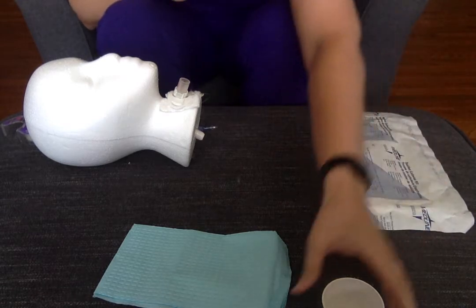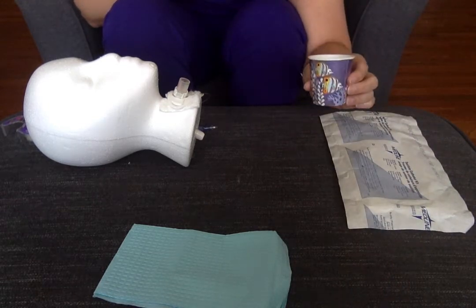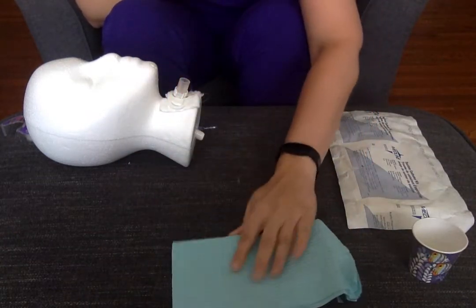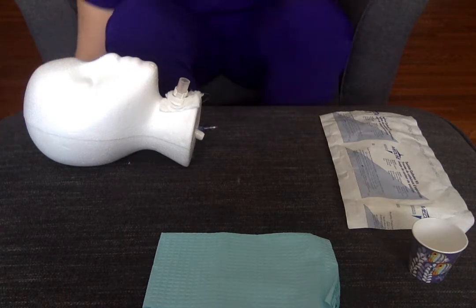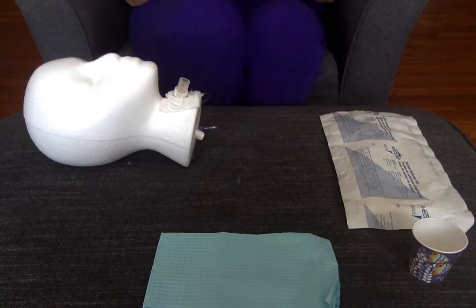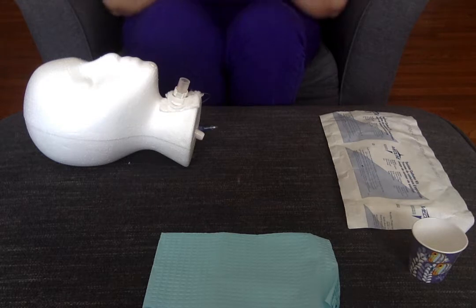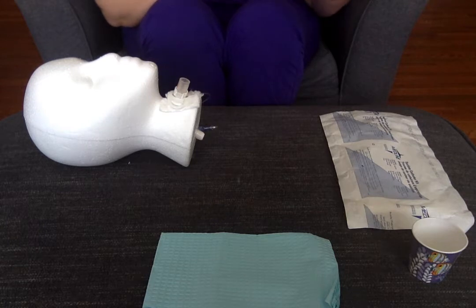You want to make sure you have your kit. This little cup is going to simulate my sterile saline pour bottle today, and then I just have something I can drape my patient with to keep their gown from getting dirty. So when we first go in, of course we should have verified the order and verified our patient, but setting up the actual skill here — one thing you can do while you still have two hands that are not sterile is go ahead and set up your suction.